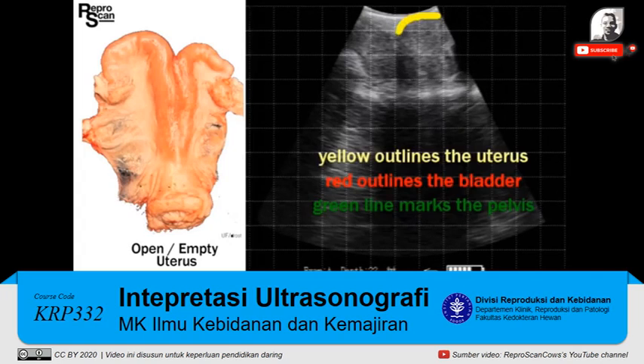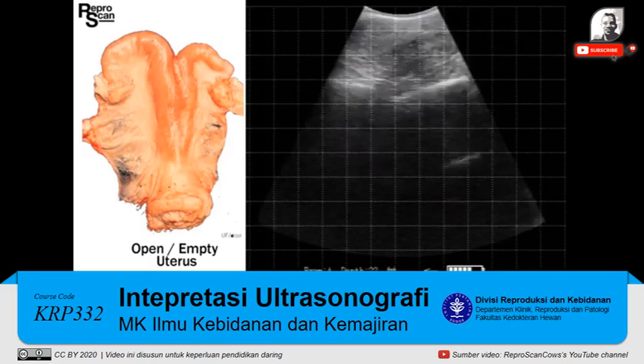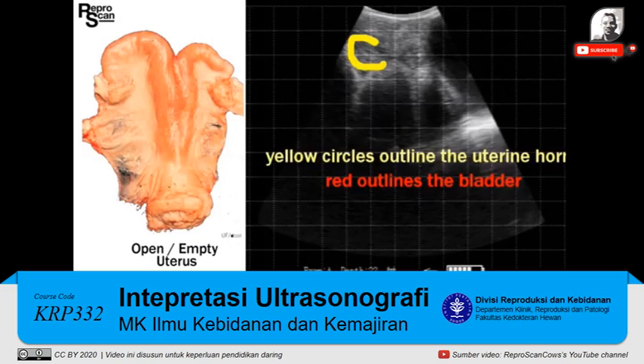Examination number 9 is somewhat similar at 22 depth. There's our uterus outlined just ahead of the bladder and above the pelvis. Vigorous rotation helps push some of the manure out of the way. A couple of clear cross-sections just ahead of the bladder.